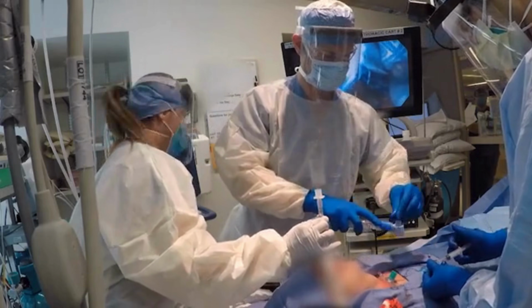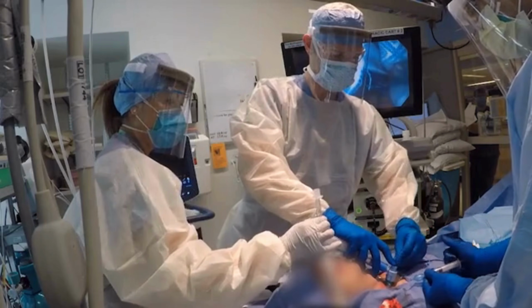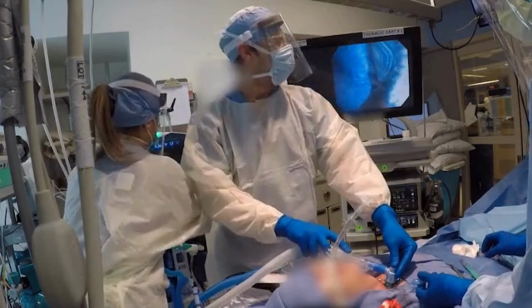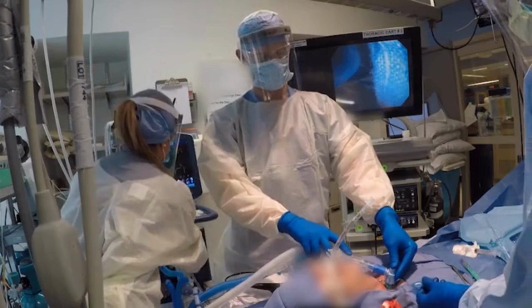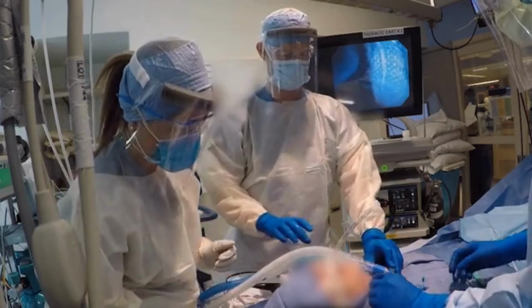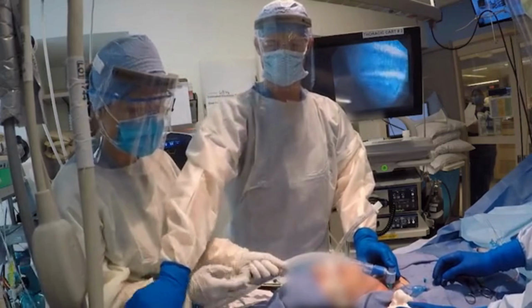Inflate the tracheostomy cuff, connect the circuit, and resume ventilation. End-tidal carbon dioxide confirms airway placement. Alternatively, reinsert the bronchoscope through the tracheostomy tube to visually confirm placement. Once placement is confirmed, secure the tube with a collar. If a purse string suture was placed, tie it down to close the incision. Once the patient is ventilated through the secured tube, remove the oral endotracheal tube.